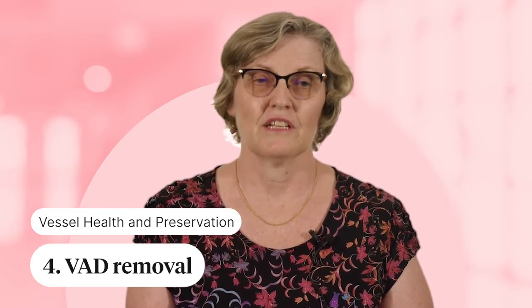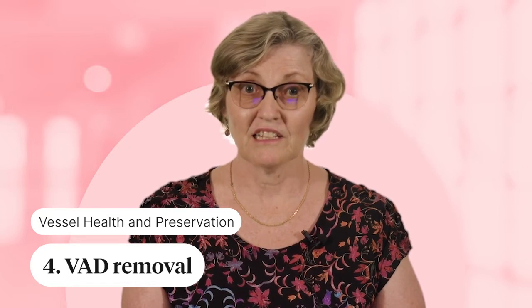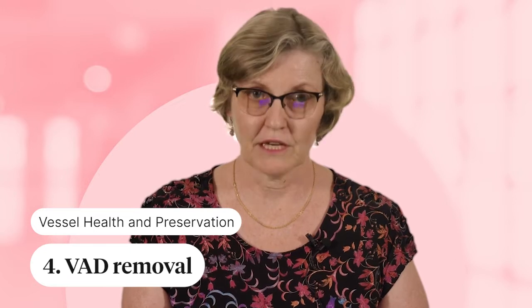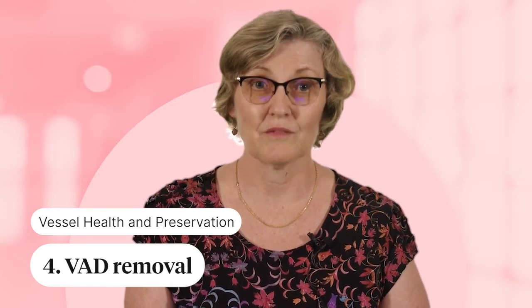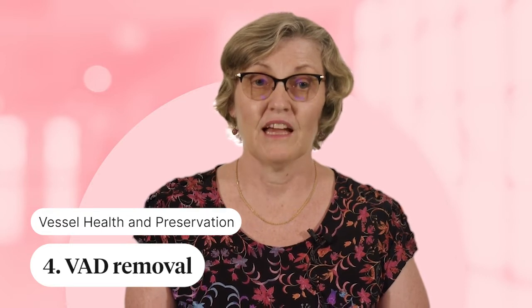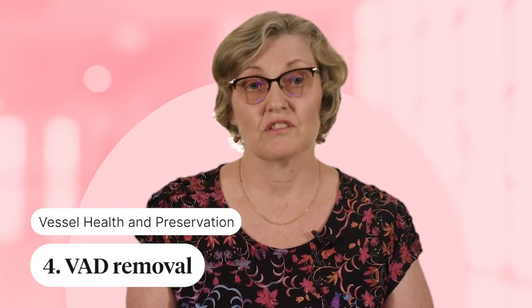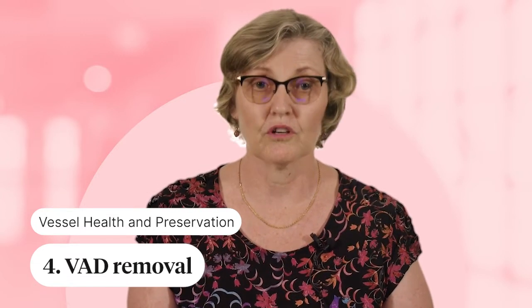Did you know that a patient can actually get phlebitis up to 48 hours after a cannula comes out? So it's important when you take it out to tell the patient, keep an eye on that site. If you've got any questions or any concerns about it, let us know. And that includes if the catheter comes out on the day of discharge, tell them, keep an eye on that over the next couple of days. And if you've got any problems at all, contact your GP.